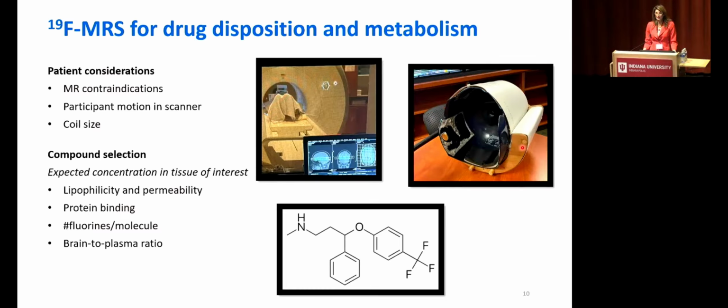Looks like a baseball helmet. And in fact, you might recognize that part, the insert, and that did start as a baseball helmet. This fits in the patient as they're laying flat, and it needs to fit nice and snug. That also helps reduce motion back and forth, and also optimizes signal to noise during acquisition.